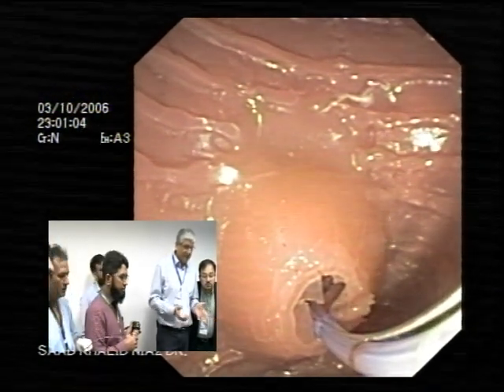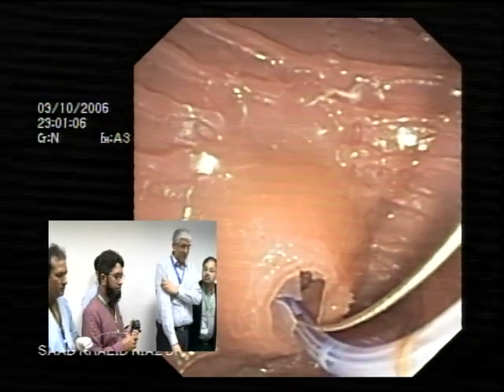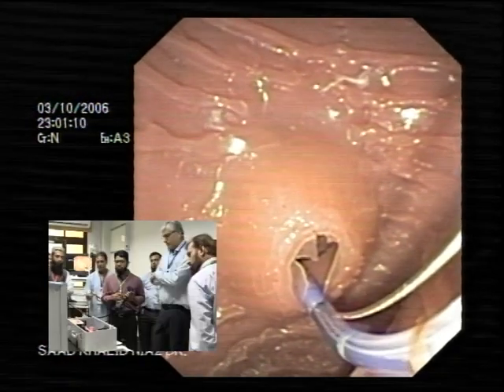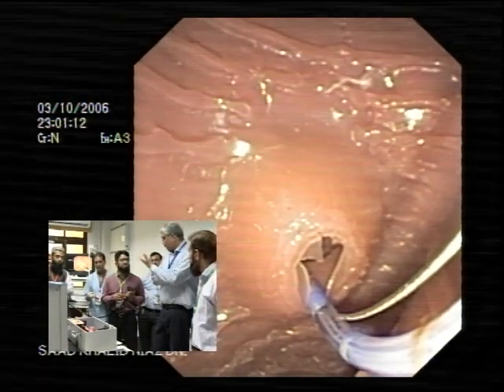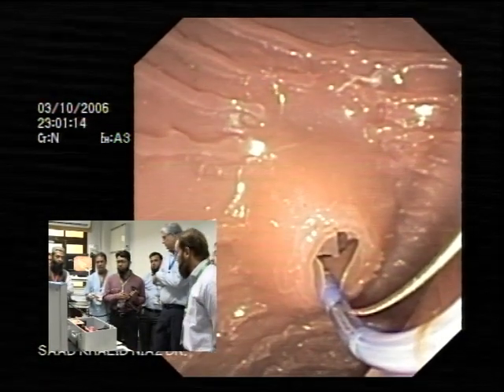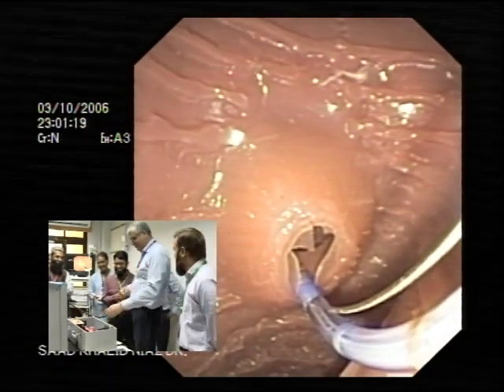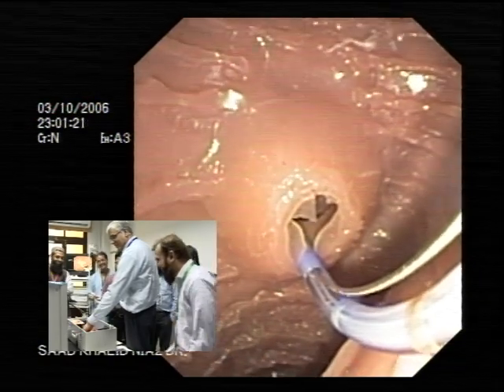So what have you done differently? I haven't seen anything differently. Na, aap karte rahe ho, lekin aap karte wahi sari cheeze rahe ho. So that's why you are getting into the pancreas. Kuch to different karna padega na. So what I'll do is I'll do what Vakar is saying. I'll give you a better position.